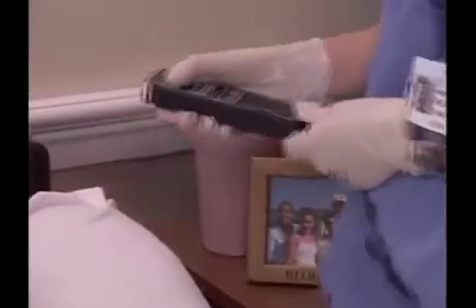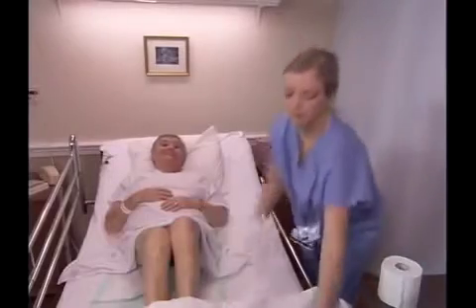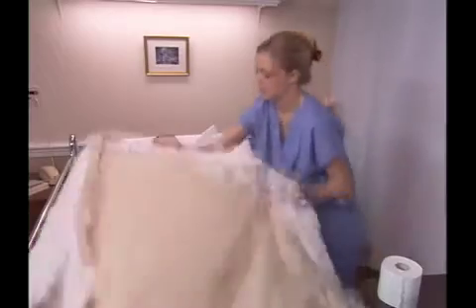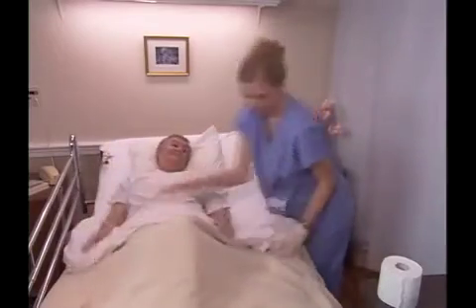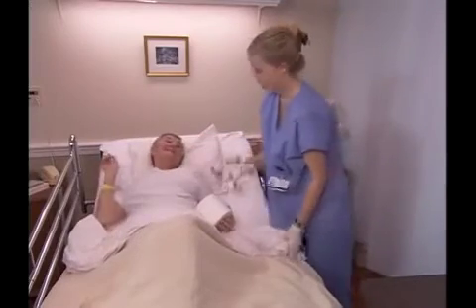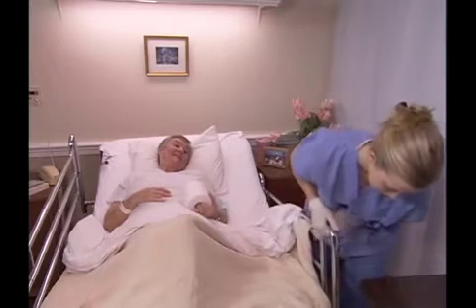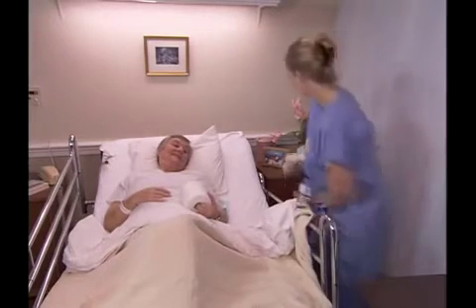Next, because most people find it easier to use a bedpan when they are in a sitting position, raise the head of the bed slightly as tolerated. Then, draw the top linens over the person for modesty and warmth. Make sure that the toilet paper and the call light control are within reach. If the side rails are in use, return them to the raised position.